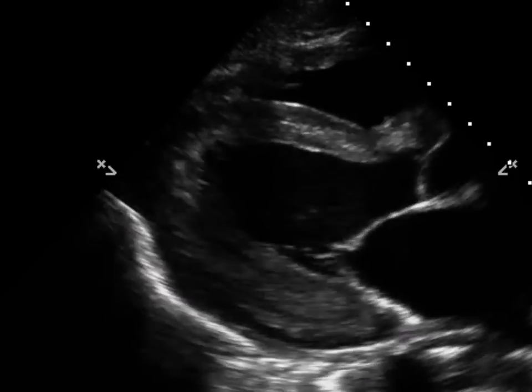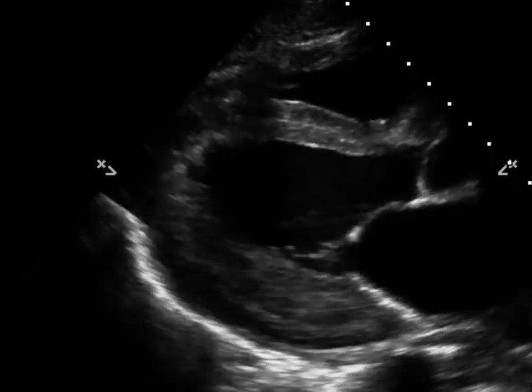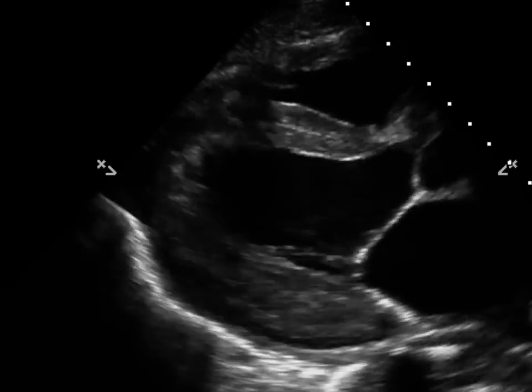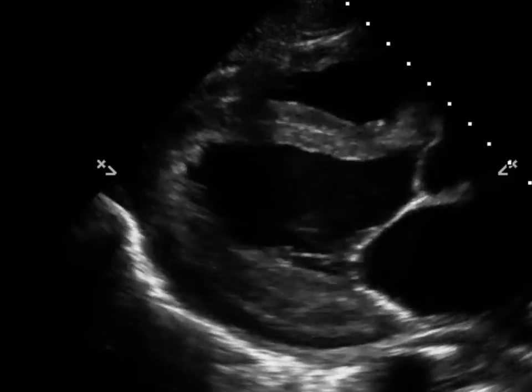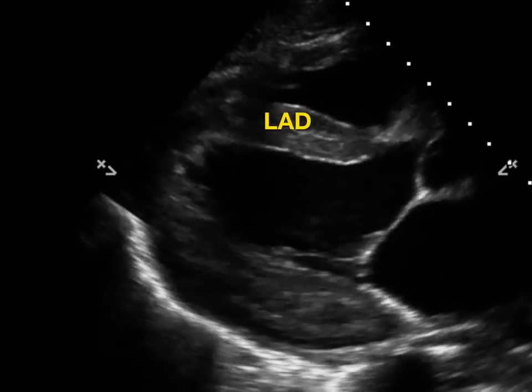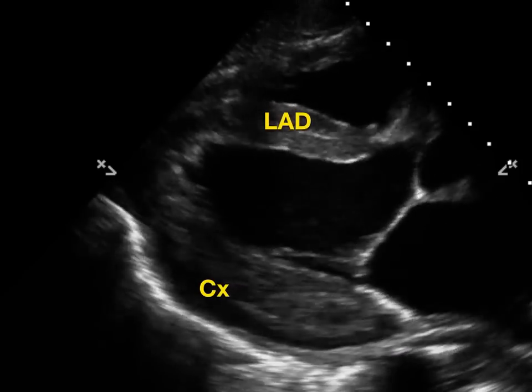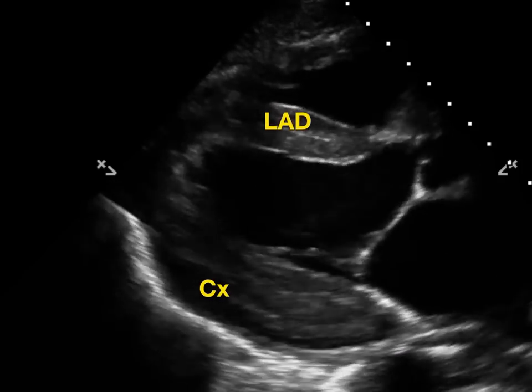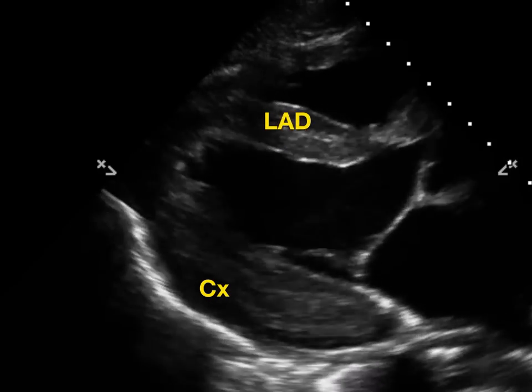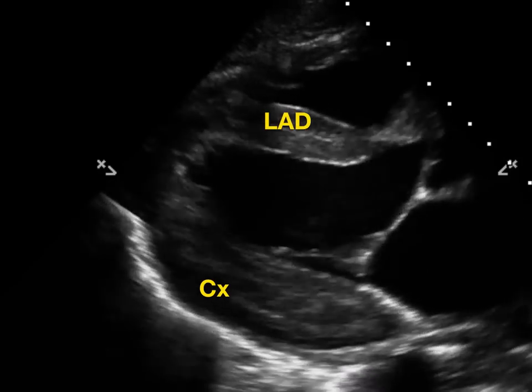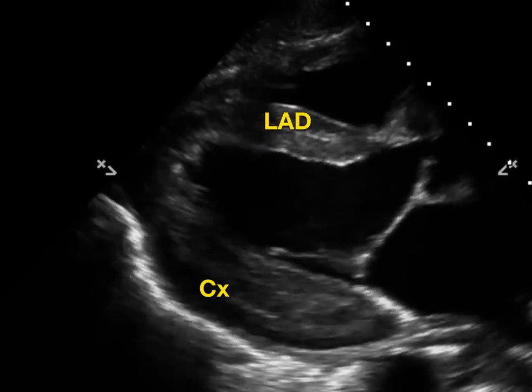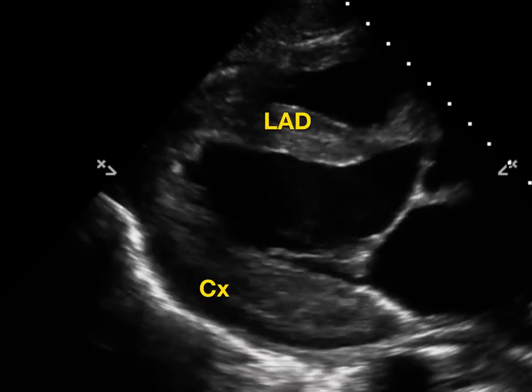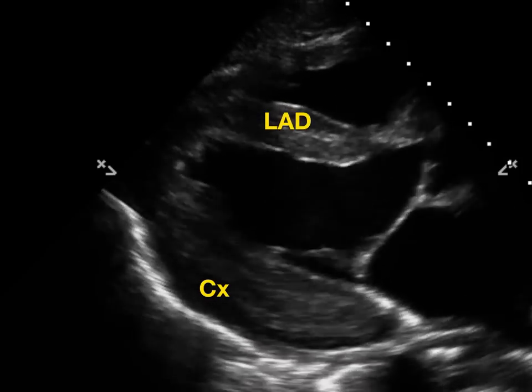Here's another example — think of where the LAD and where the circumflex is, and we're looking for any wall motion abnormalities. This is a pretty good example of a circumflex lesion.